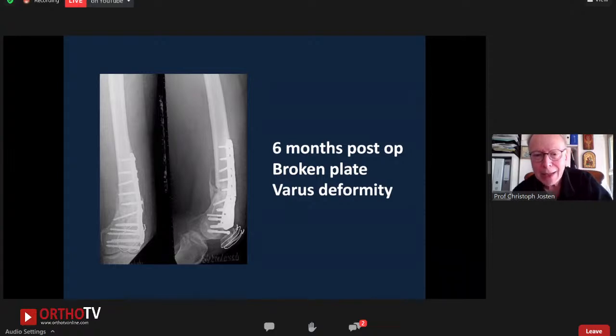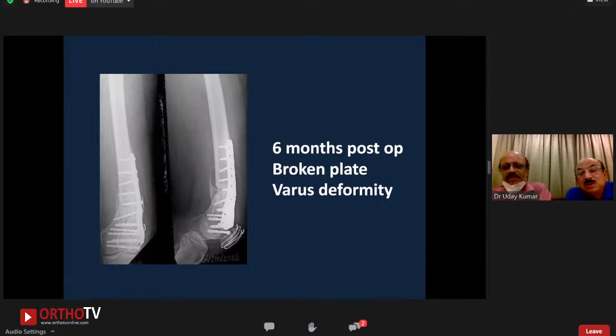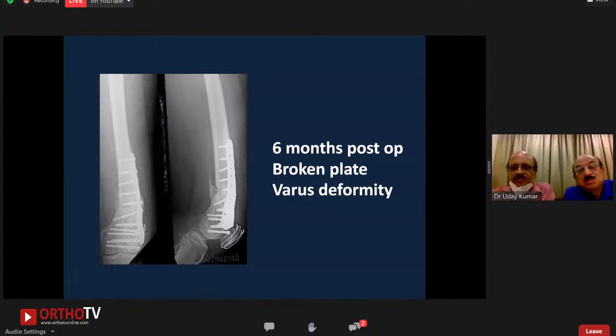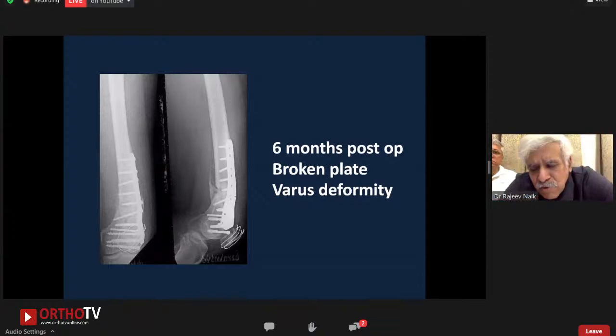I don't know how old this patient is, a young patient, 18 or 20 years. Young patient, yeah, 18 years old. So I would go in this case with a new plate, correct the varus, and make an additional medial cancellous bone graft. This would probably be my first choice. Professor Krettek, how about you, sir?